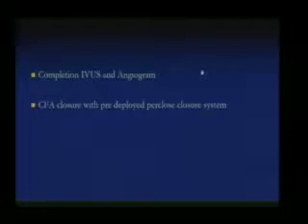So after deployment of the stent graft, we did not post-dilate this, as we sometimes do for aortic dissection. We usually post-dilate the stent graft, but for transection, because the aorta already has the injury, you do not want to create more injury. So we elected not to perform any post-dilatation of the stent, and we had good flow through the stent.